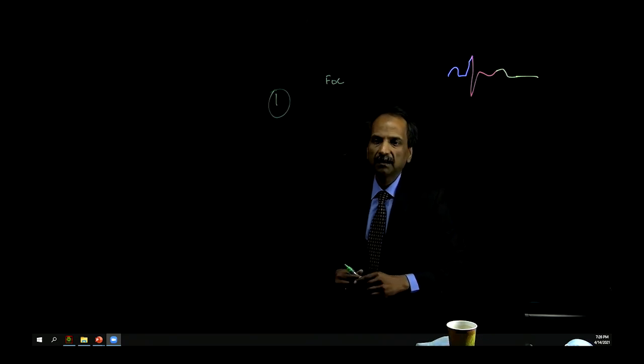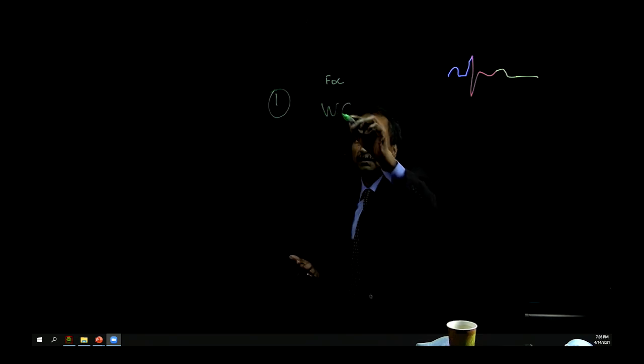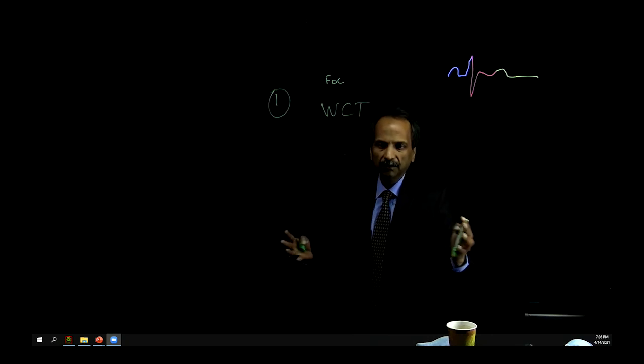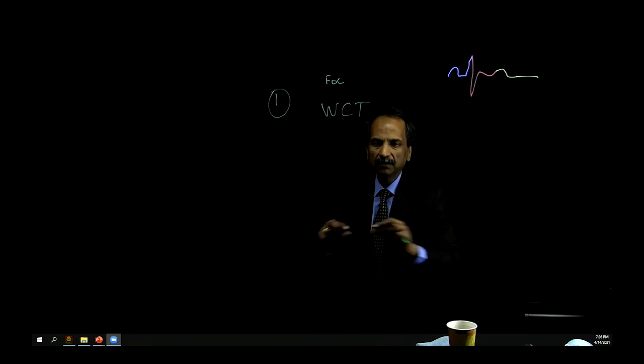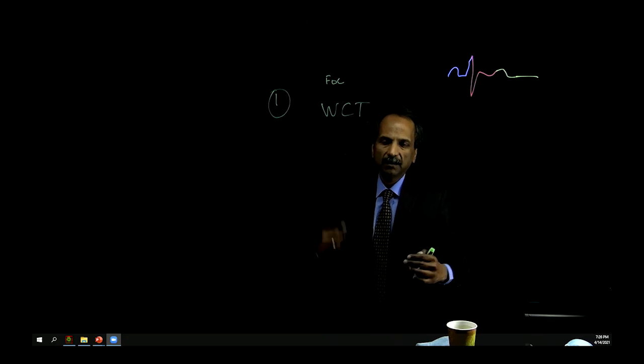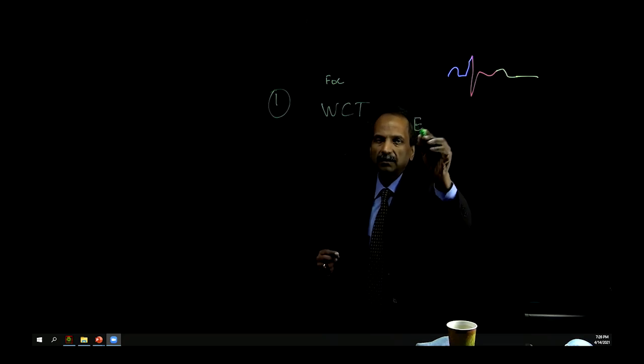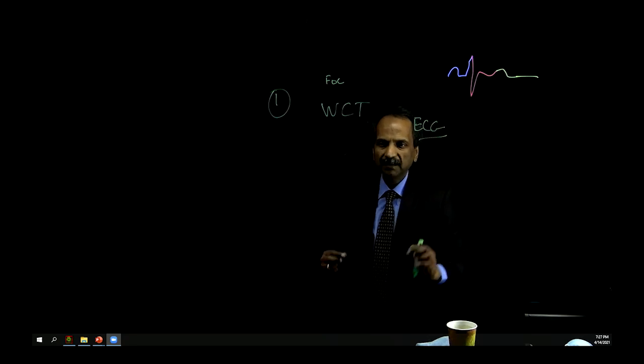Second big caveat is, what are you using to create your unipolar recording? The most common is using the Wilson central terminal. So just like an arithmetic game with the ECG leads to create a zero potential, and that's used as a reference to generate our unipolar signal. Put another way, what this is saying is your unipolar recording is as good as your ECG. If your ECG has random noise on it, you're always going to get baseline waver on your unipolar recording.